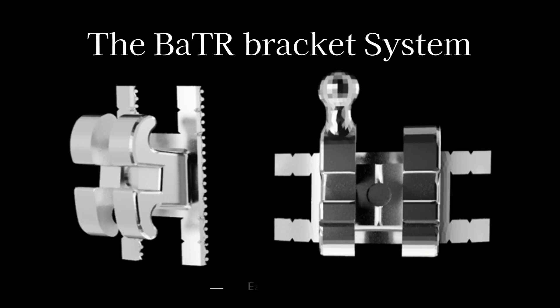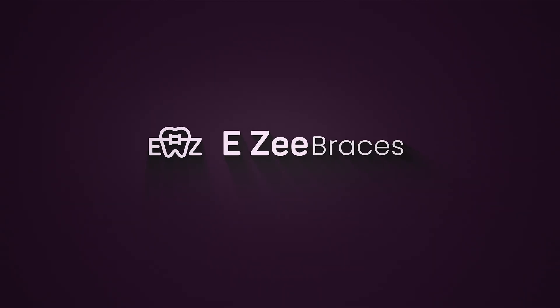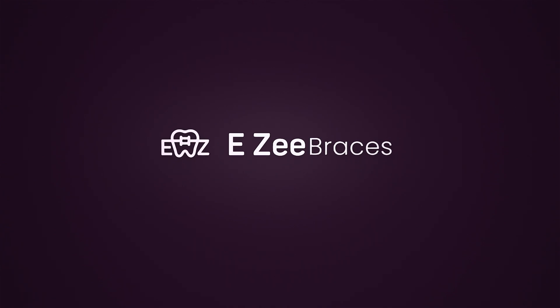Innovations that simplify your life. Use the Bite Maker and the BATR bracket system for complex crowded cases.